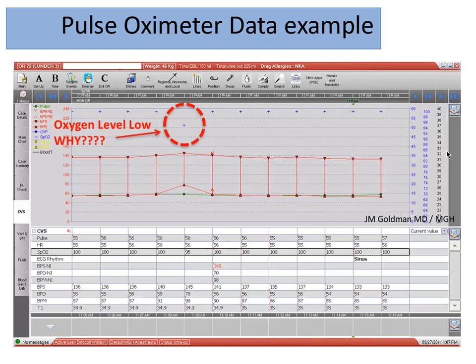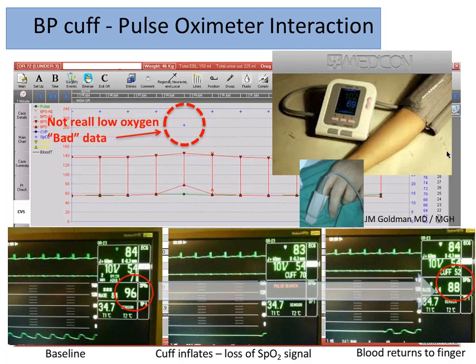What's really happening in this case is the patient is fine — it's just the blood pressure cuff inflating on the same limb as the pulse oximeter. You can see the baseline saturation is 96%. The blood pressure cuff inflates and cuts off blood flow to the limb, so the plethysmogram from the finger flattens out. As the cuff deflates, blood returns to the finger but there's a period of instability in the pulse oximeter measurement. It just so happens that during that period of instability the EMR captured the value and put it into the record.